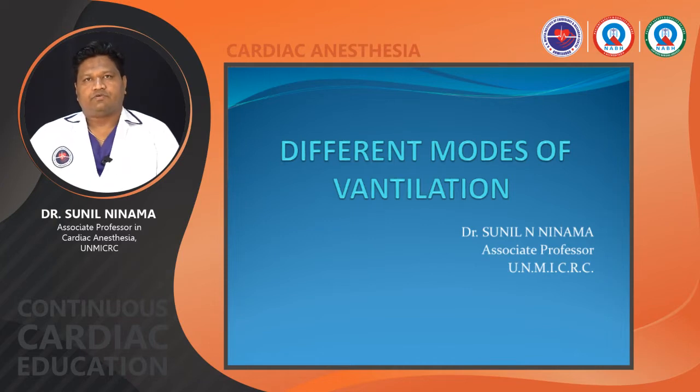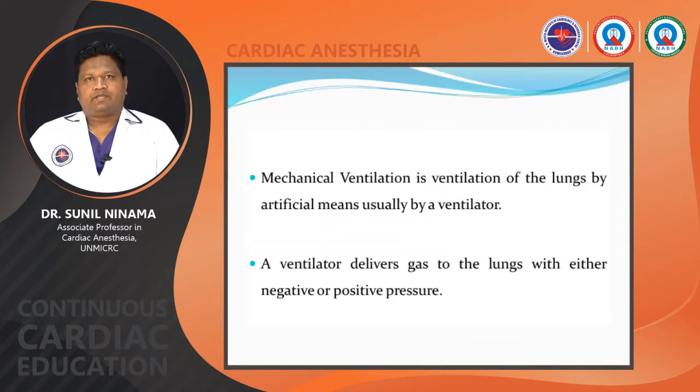We'll start with, what is ventilation? Mechanical ventilation is the ventilation of the lungs by artificial means, usually by ventilators. And what does the ventilator do? The ventilator delivers gas to the lungs with either negative or positive pressures.